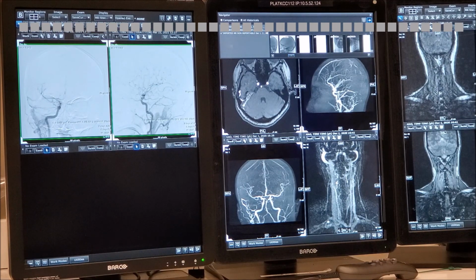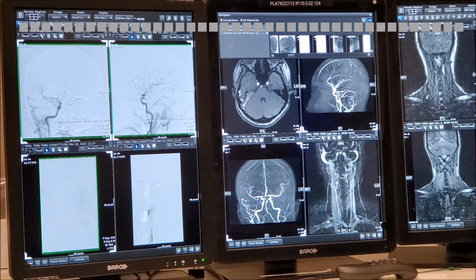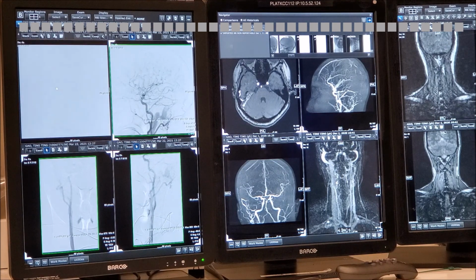One thing that I'm always fascinated by is that patients with AVMs seldom, no matter the age, have atherosclerosis. I think the increased flow somehow protects you. So the common carotid artery is not very useful. We're going to use it the same way.